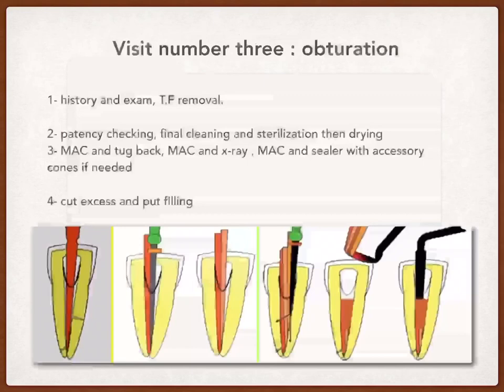After the completion of the instrumentation procedure, we will shift to the last visit, which is the obturation procedure.